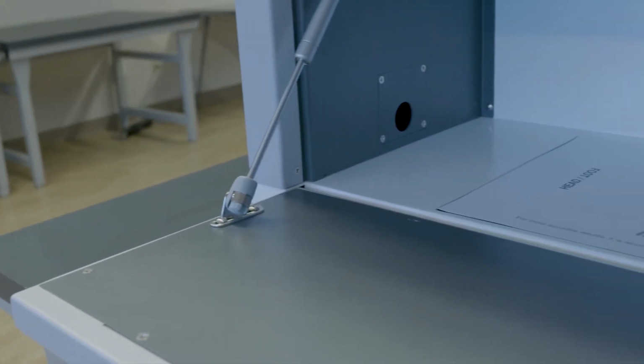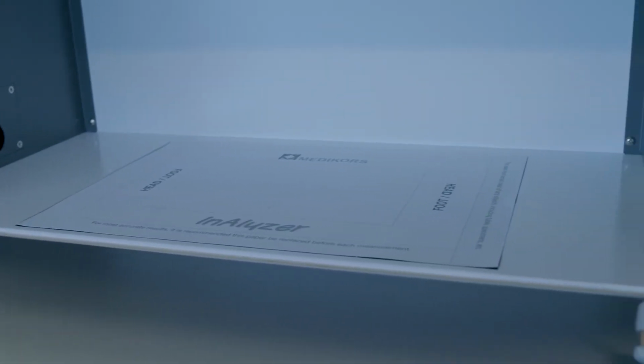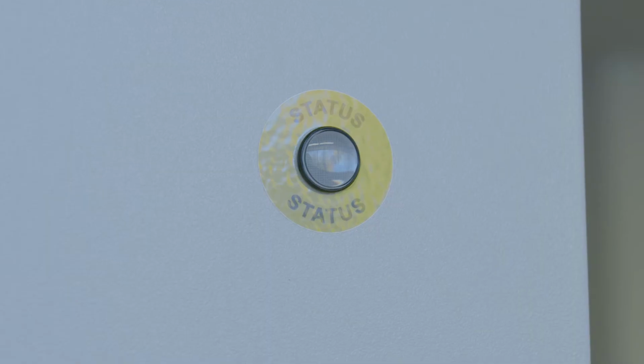So over the lifetime of the animal, we can scan the animal several times and track the physical changes in the animal, either to fat content in the animal or the bone quality. And you can do that with the same animal multiple times, so it reduces the amount of animals you need for a study. Rather than having to sacrifice animals at certain time periods, all we do is put it under anesthesia, put it in, scan it, and we get those results anywhere from 1 minute to 5 minutes.